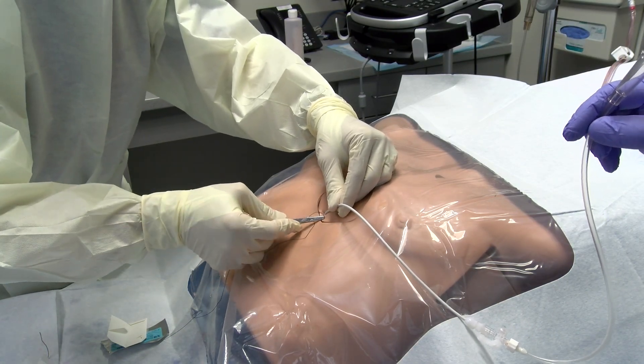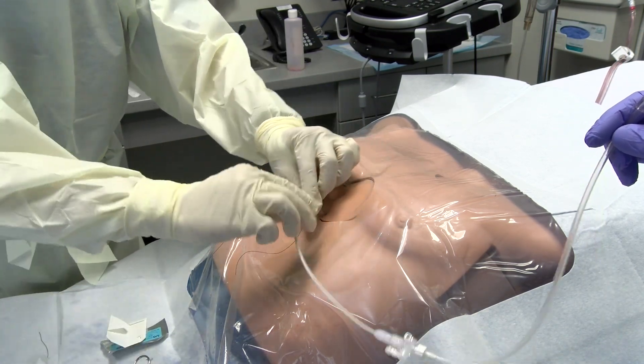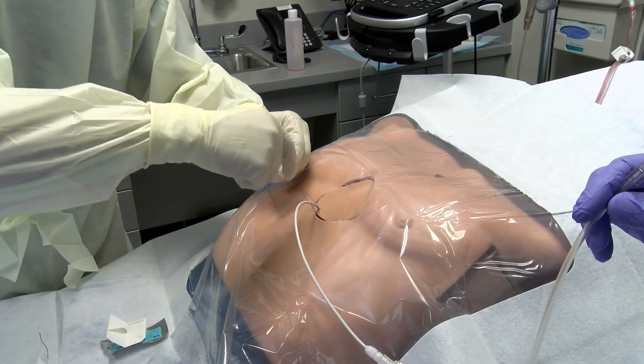The catheter can be secured to the skin using suture, either by tying it directly or with a Roman sandal-style wrap similar to that of a chest tube.